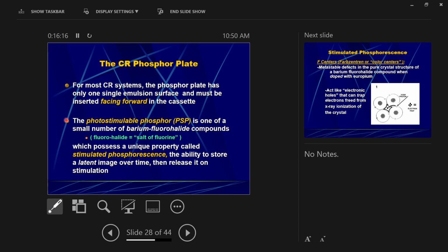Yeah, they're pretty neat. They have only a usable life. Usable life for these plates is something between 3,000 and 5,000 images, 3,000 and 5,000 exposures. It's typical for a plate to get that many exposures within about a year or two. Okay, so these plates have to be replaced periodically.